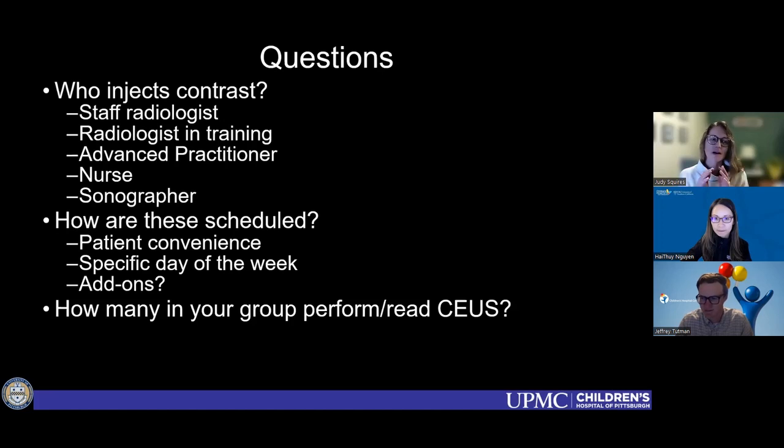I'll answer that. We only have a handful of us who are willing to. Maybe not willing, because a couple of my colleagues don't really want to do these, but they will do it because I'm not there every single day. We are training our fellows to administer the contrast. We started that last year because our practice is a little different. We have several radiologists who are exclusively located off-site, so they physically cannot be in Pittsburgh to give this contrast.